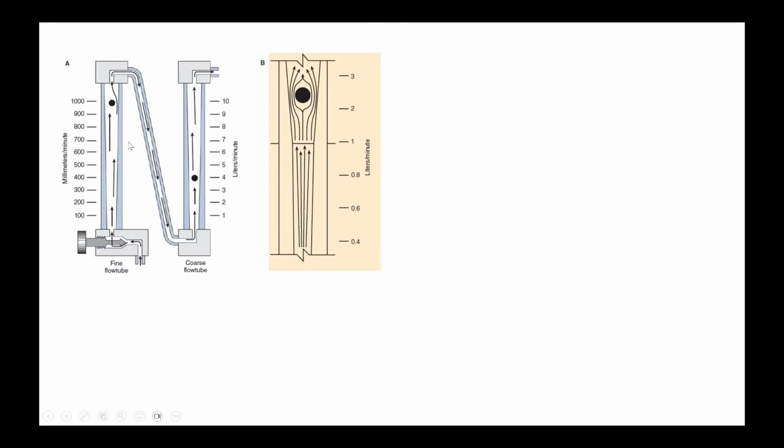Nowadays, the concept is to use as minimal an amount of gas as possible to avoid, number one, wastage, and two, to remove the unnecessary pollution that will happen if these excess gases are vented out of the machine. So that is the main reason we are now using the concept of low flow anesthesia, where there is a minimal flow, metabolic flow, basic flow. Sometimes we reduce the flow to even 500 milliliters of oxygen to 500 milliliters of air or 500 milliliters of nitrous oxide, whatever you are using.